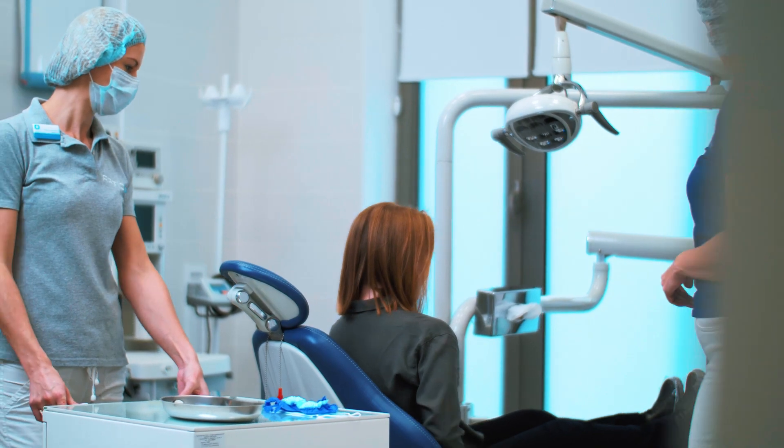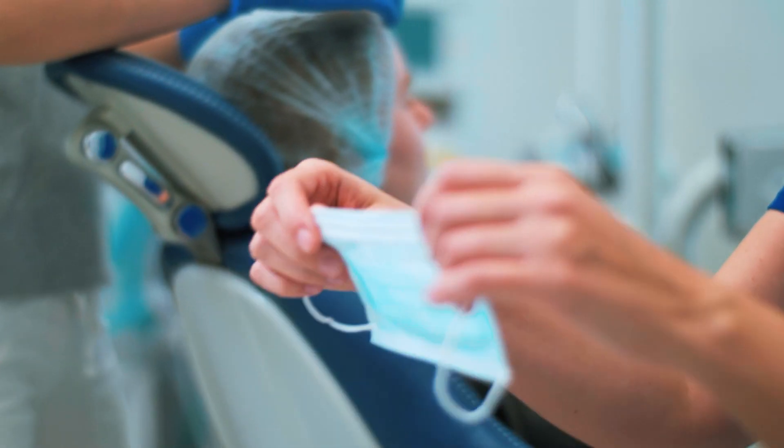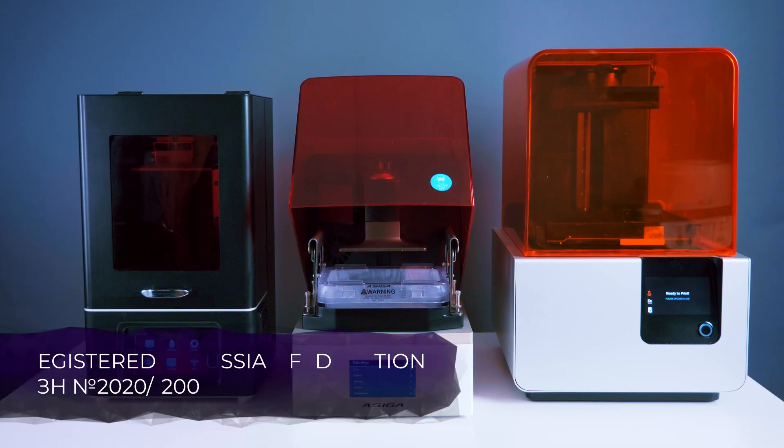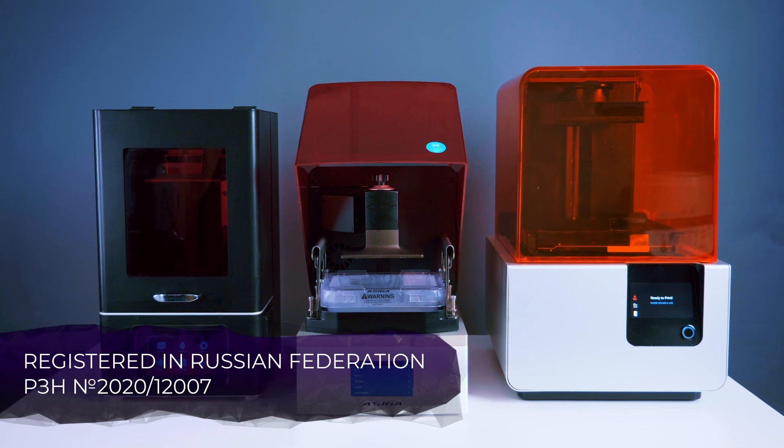In dentistry, crowns and bridges are an integral part of the workflow that requires maximum manufacturing precision with minimal time. A digital protocol allows you to solve both of these tasks.